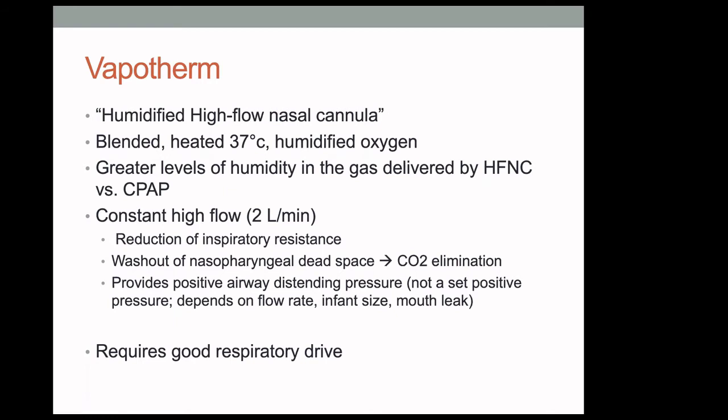It's meant to be more physiological because it is heated to body temperature and humidified, and this helps to mimic the type of air you would get delivered into the airways, which would reduce your metabolic requirements.